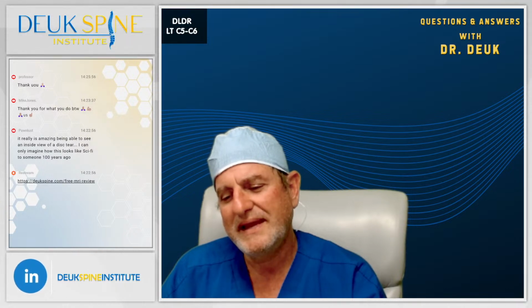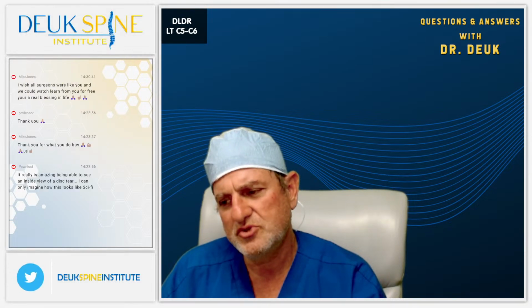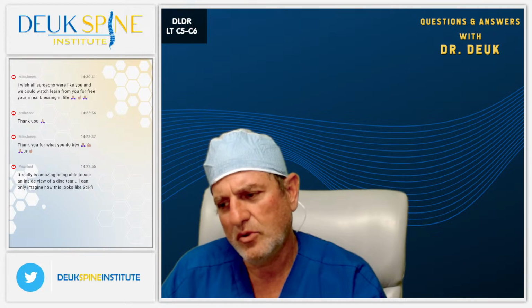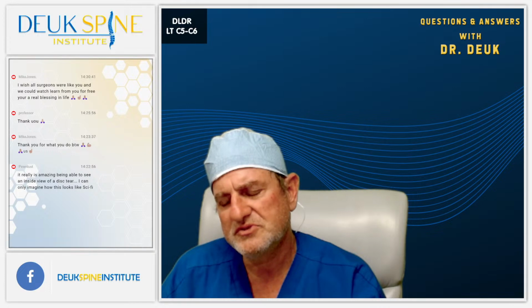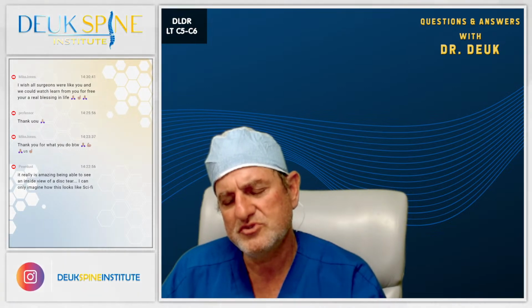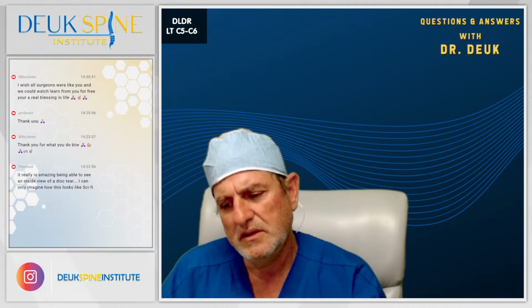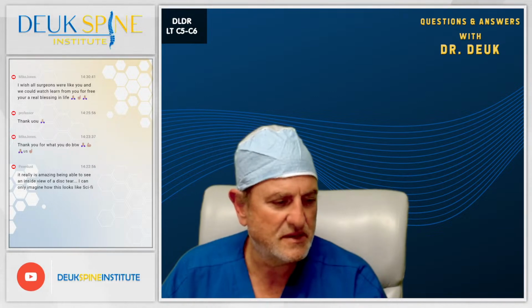I would love to know what endoscopic system you use. I use the Wolf. The system I use is the old Wolf system. I don't like the new one. It's too big. And I have an old principle: if it isn't broken, don't fix it. I've never had a problem with the old system, so I keep using it. I've evaluated the new systems. I don't like them as much, but Wolf refuses to accommodate me and keep the old system. So we're using equipment we've had for 18 years, and it works great. We just keep getting it serviced, maintained, and fixed as needed.